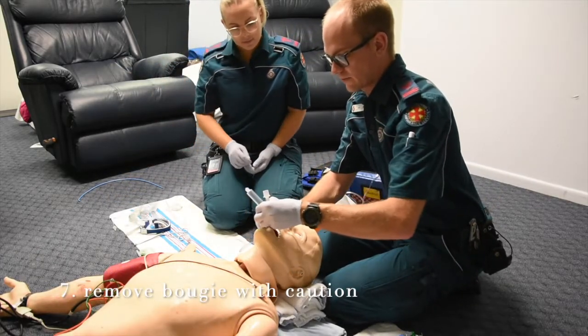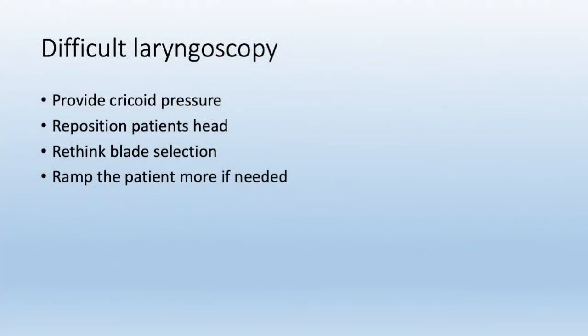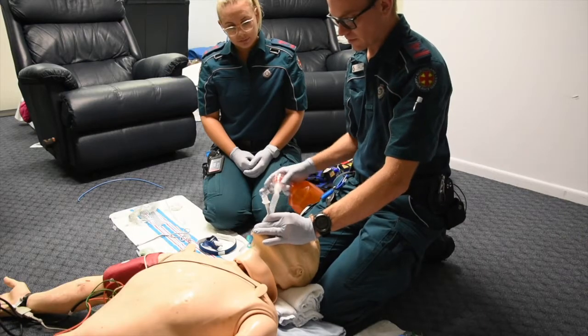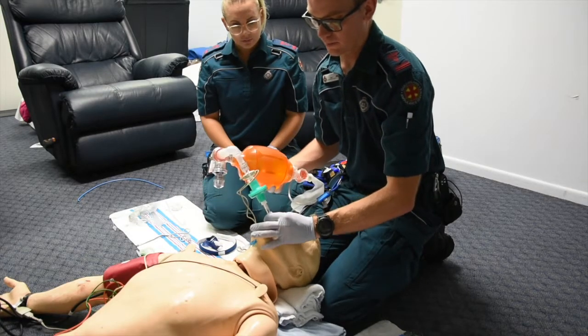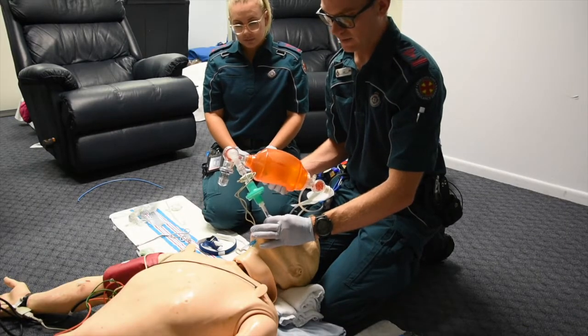If I was to find that difficult, I can always provide laryngeal manipulation. I would do that with my non-dominant hand, or also my right hand, and how I do that is I would push down. I could use backwards, upwards, rightwards pressure, or just manipulate until I could see the chords. Then from that, I would pass it over to my colleague to place their hands over my hands, so that I can continue with the intubation.